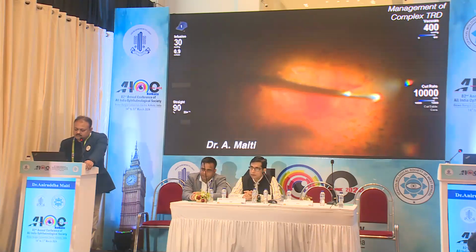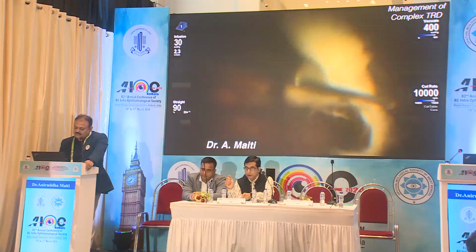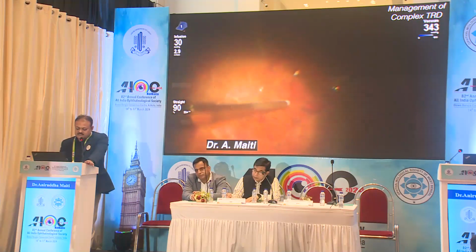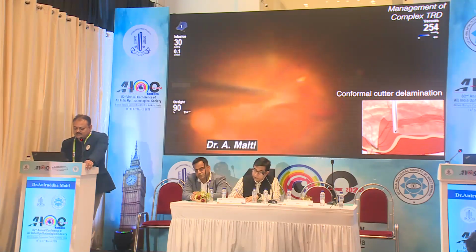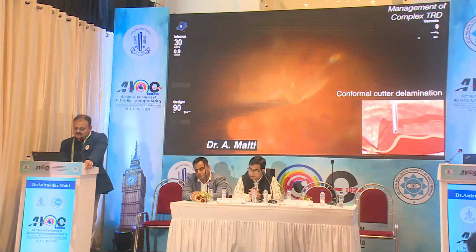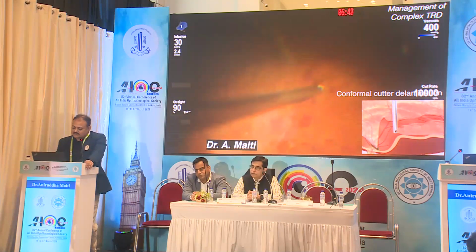You can see a very tabletop TRD case over here, even more difficult than the previous one. Meticulous dissection, finding the plane of dissection, is very important. Once we get the plane, we can do a conformal cutter delamination. We have to go along with the shape of the probe so that we don't touch the retina.